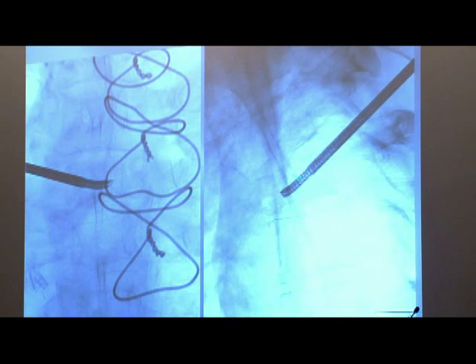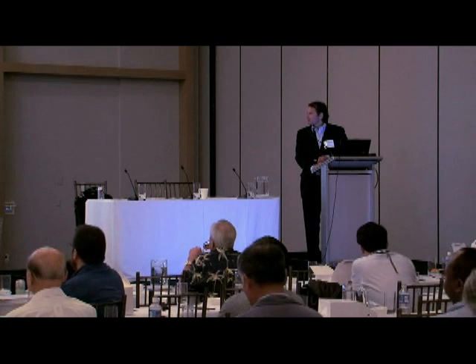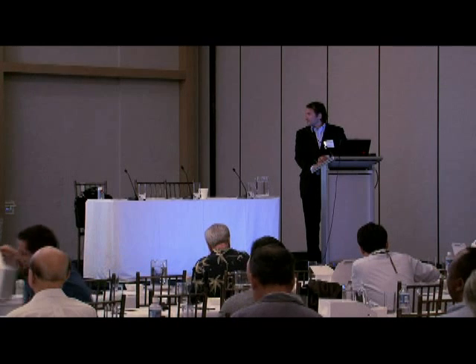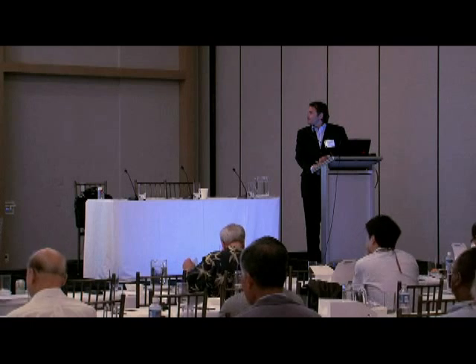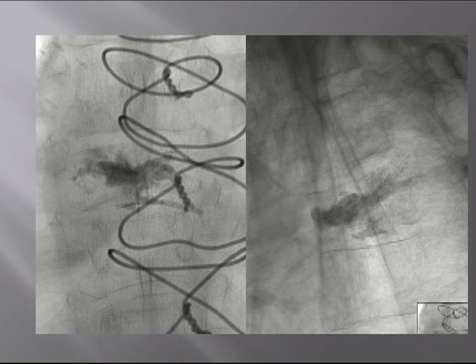The cavity creator osteotome device is pretty sturdy, even for partially sclerotic regions, and you can cross it over to the contralateral side, create your cavity, and fill it with cement. There is minimal leakage visualized here. This is controlled, and the patient doesn't have much osteoporosis, so there's little risk of an additional level fracture here.